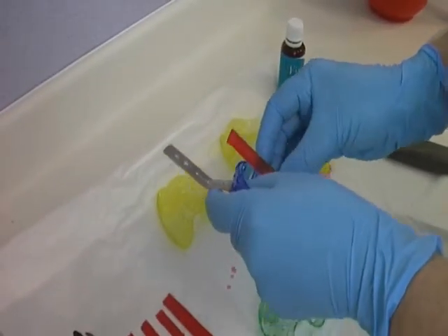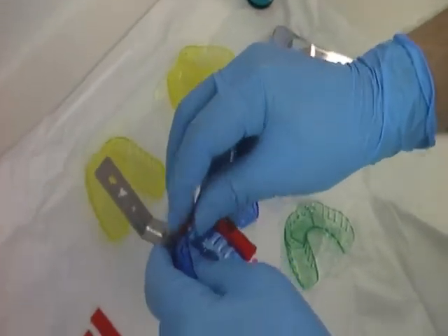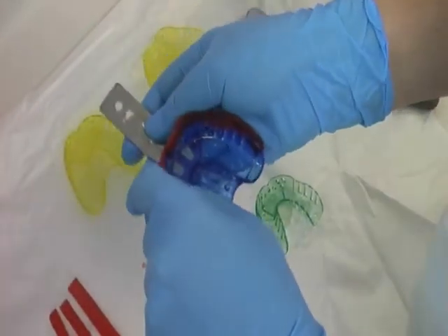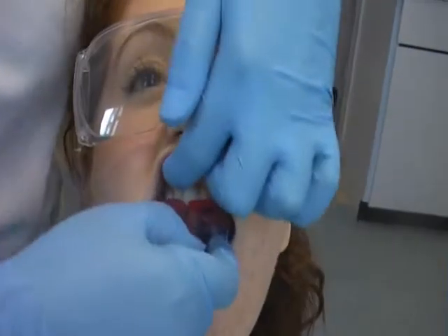An underextended impression tray can be modified with the use of ribbon wax. This ribbon wax is moulded around the borders of the stock tray as shown here. A tray that is underextended will have insufficient detail and therefore produce an inaccurate impression.